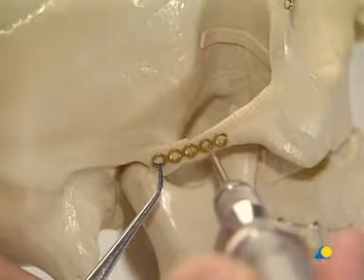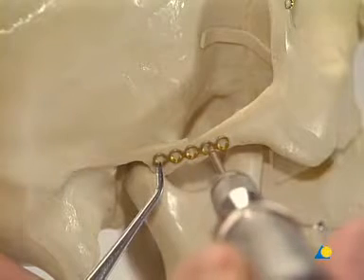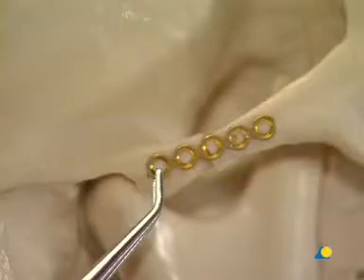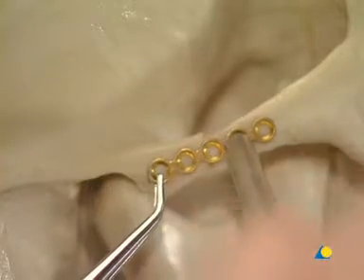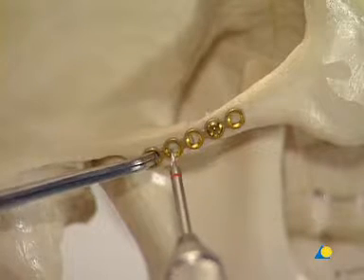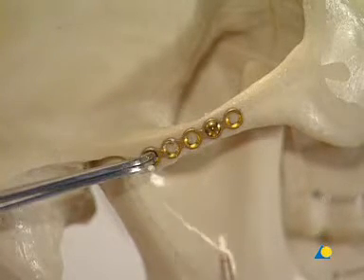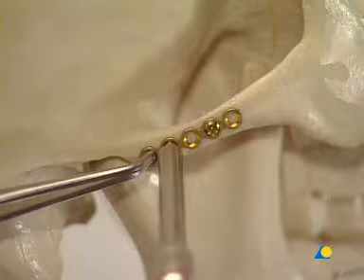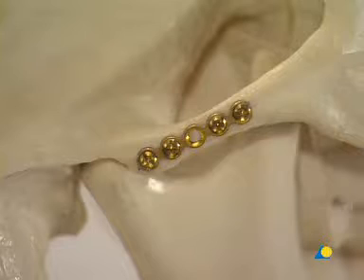The first hole is drilled next to the fracture line in the zygomatic portion with a 1.1 mm drill bit with a 6 mm stop, and a 6 mm long 1.5 mm screw is inserted. Another screw is inserted on the opposite side of the fracture line. Traction on the plate can be used with two more screws to achieve a better reduction of the zygomatic arch. Two more screws are inserted, one on each side of the fracture line.